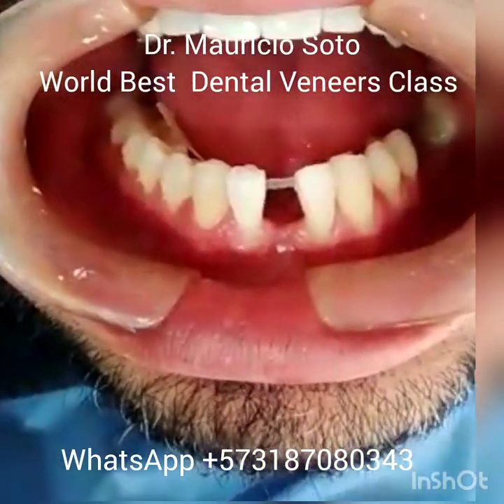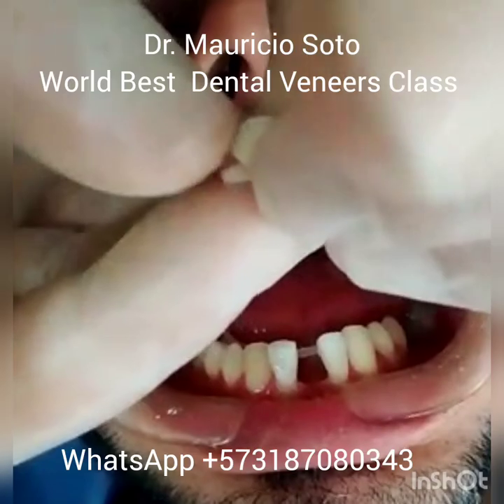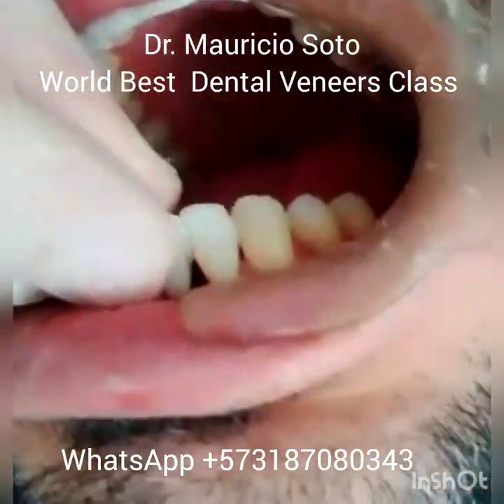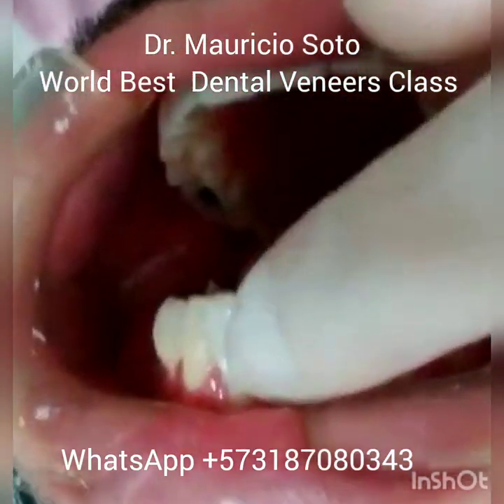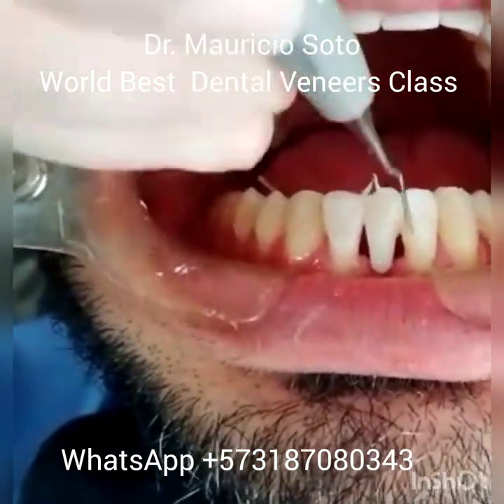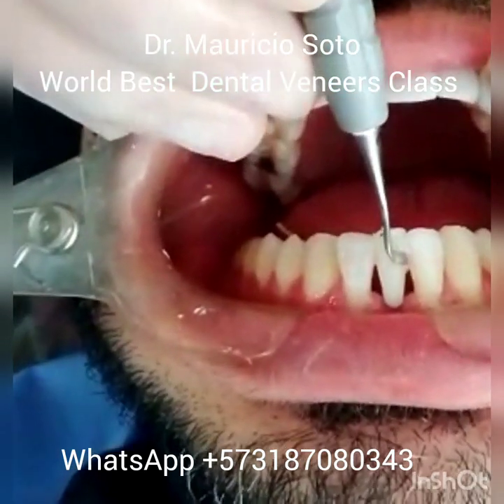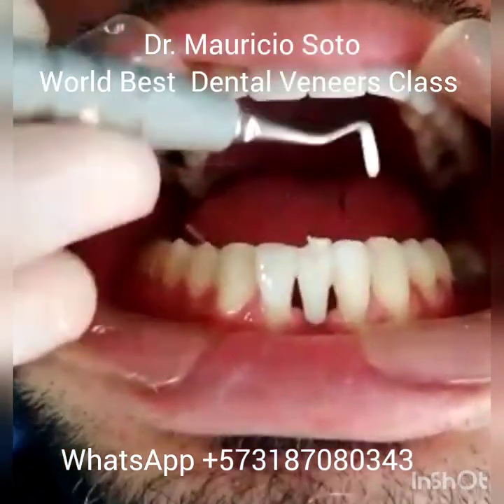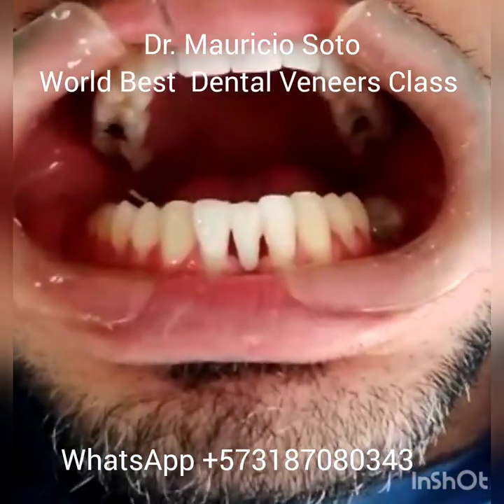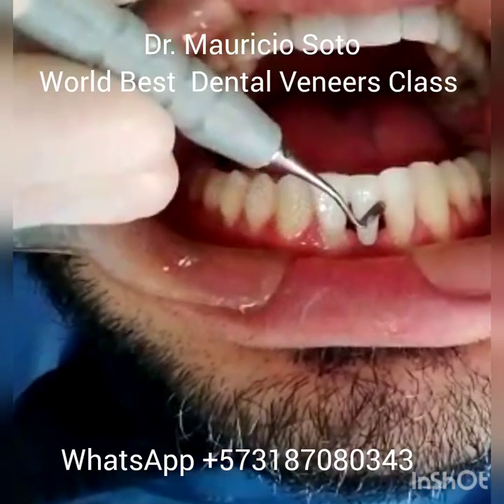After this, after hardening the composite, you are ready to put the denture tooth over the fibers. Now you put all the composite on the back side of the denture tooth that is going to replace the missing tooth. Take your time and adapt and fit the position very well, so that the replaced tooth has the right position in the mouth and fits well with the other teeth. Use a spatula to remove the excess composite.